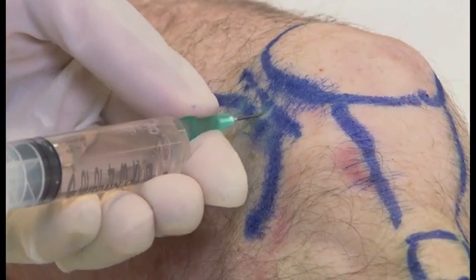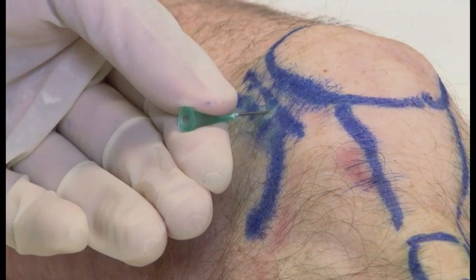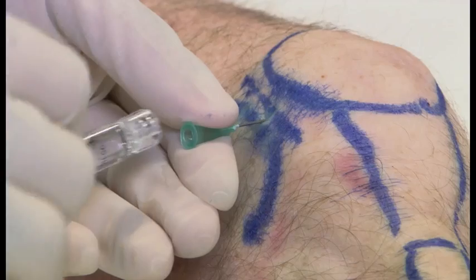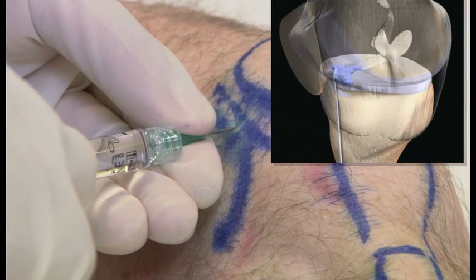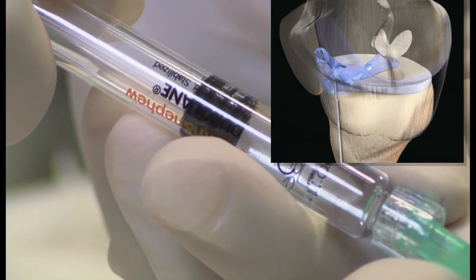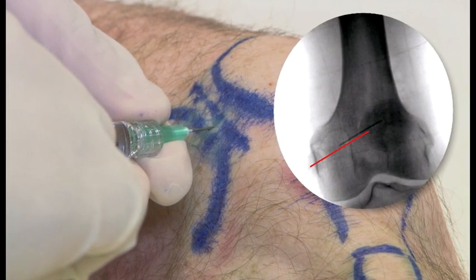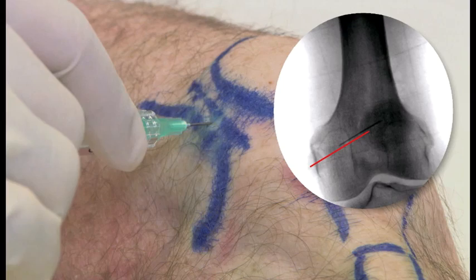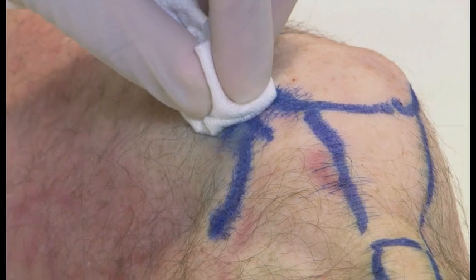Then, once one has aspirated enough fluid, with the needle still in the joint, exchange syringes, injecting the Durolane, slowly injecting. And again, not burying the needle too far in case the patient were to suddenly move, the needle may break off. And then finally, some gauze and remove the needle with some gentle pressure over the wound.